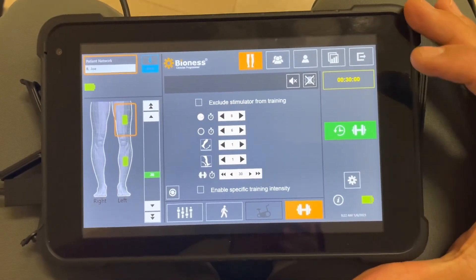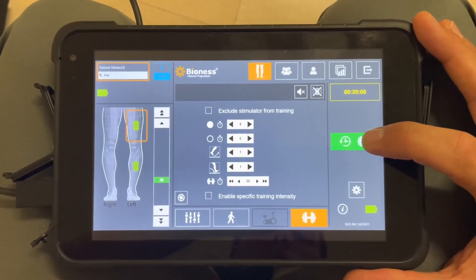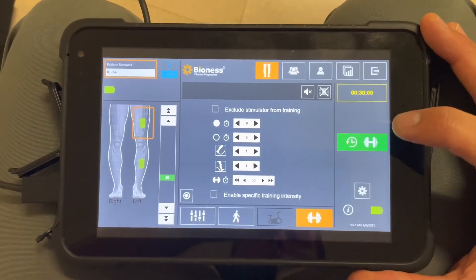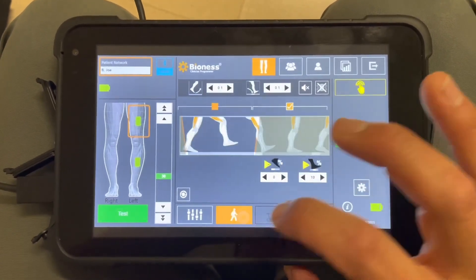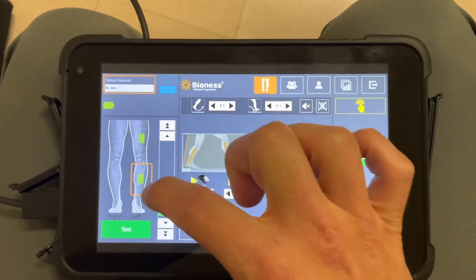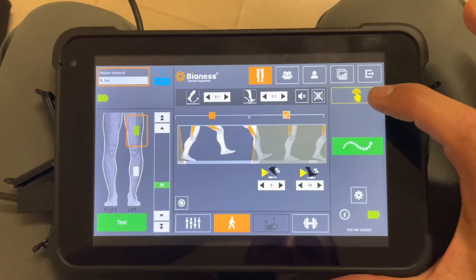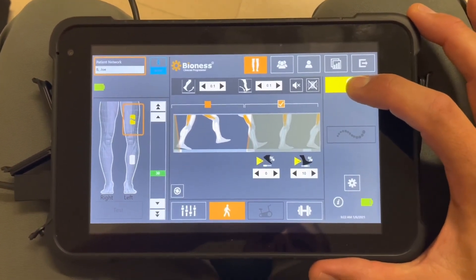You'll recognize the training mode screen here. When going into concentric versus eccentric repetitions, I have the lower cuff excluded from the stimulator. If you want to break up isometric versus concentric versus eccentric, go to gait mode. You can either set the lower cuff stimulation to zero, or hold that green square or rectangle for about three seconds until it turns white. Then you can give manual stimulation by holding the button without giving stimulation to the lower cuff.